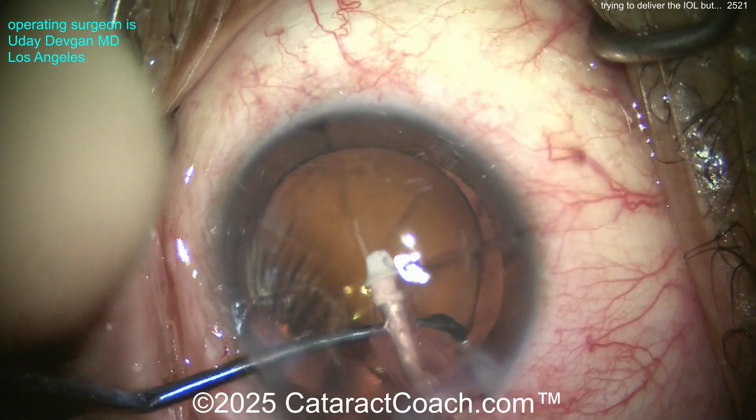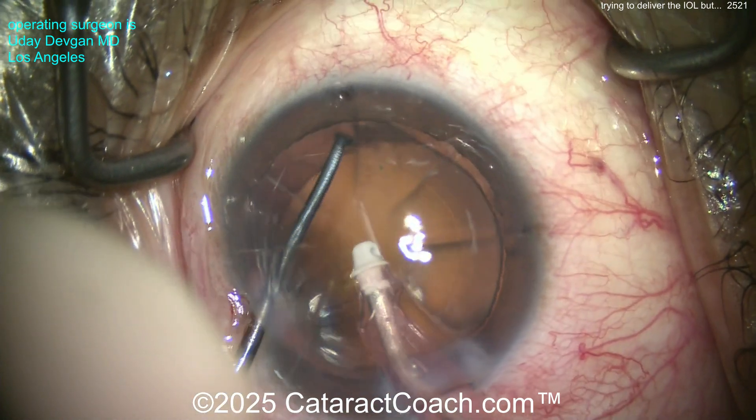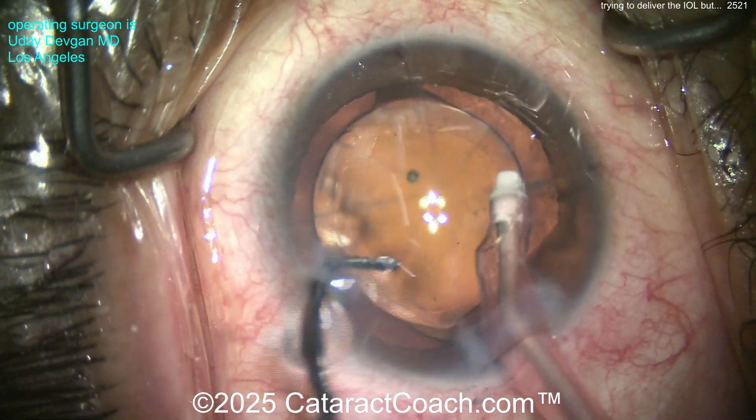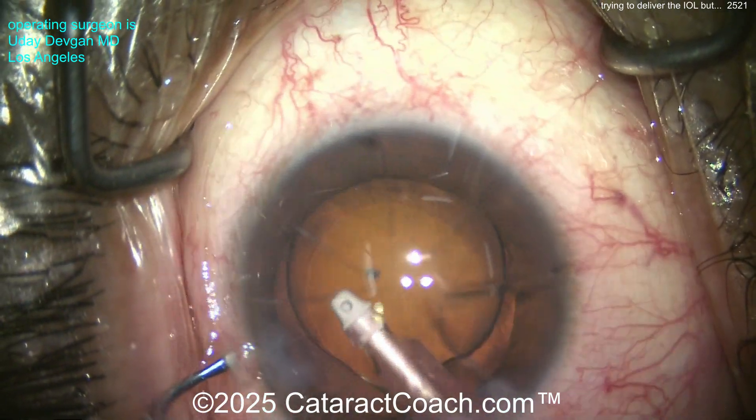You've got to be super careful not to damage those RK cuts — don't intersect them. A patient like this should wear eye protection for high-risk activities; one hard hit to the eye can open up those RK incisions. Now it looks like a toric IOL — yes, there are the toric marks on the lens. Get that oriented where it needs to be.